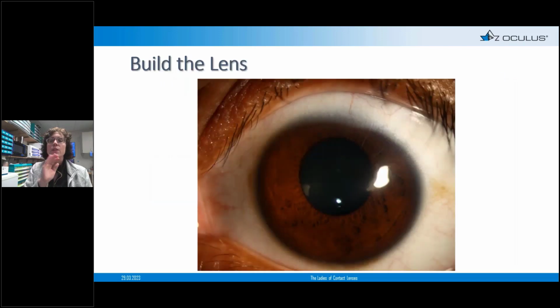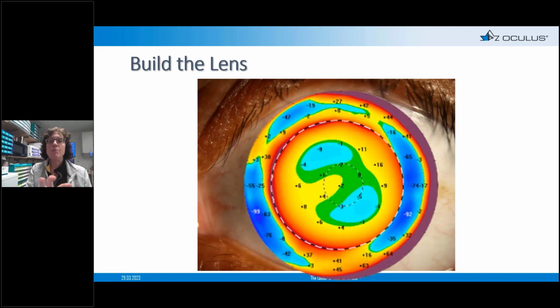Okay. So let's build the lens on this particular patient's eye. So you'll see in this particular patient, he's got something interesting going on at that superior limbus. He's got some little pingueculas. Okay. And then we put the CSP design right on the patient. Now in this particular patient, it's not a bitoric periphery. He's got some irregularities all over on that scleral landing haptic there. And his max to min in this particular case, as Dr. Fadel was pointing out, is about 150 microns. Go ahead.